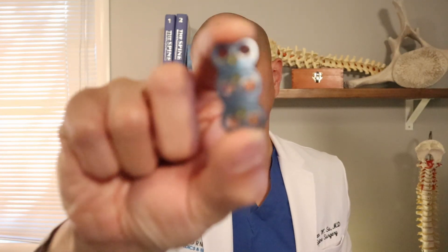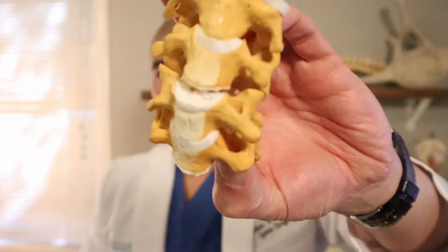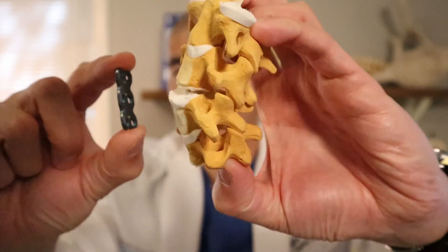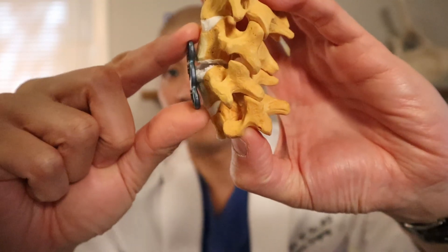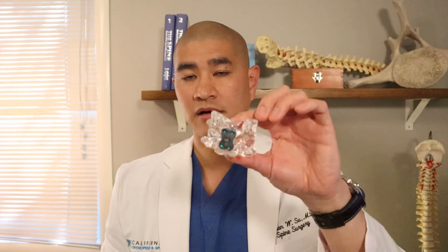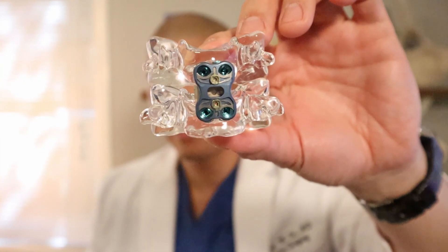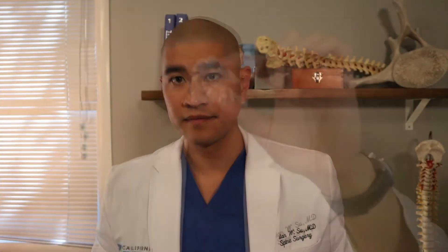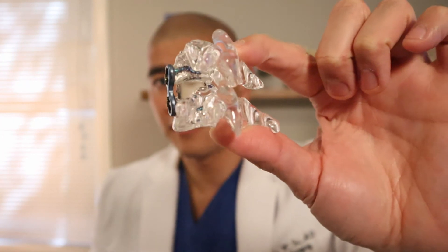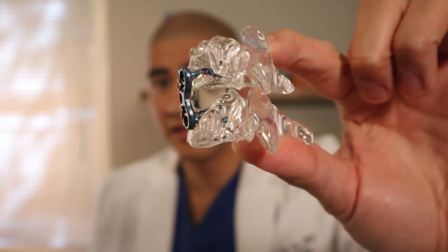Here's what a plate looks like — this is a two-level anterior cervical plate with holes for screws. Once we take the disc out, we affix the plate to the front of the spine and drive screws through these holes so the spine has stability. Here's a nice acrylic model of a single-level ACDF showing the screws through the plate, and here in the side view you can see a plastic cage was used with screws driven into the bone.